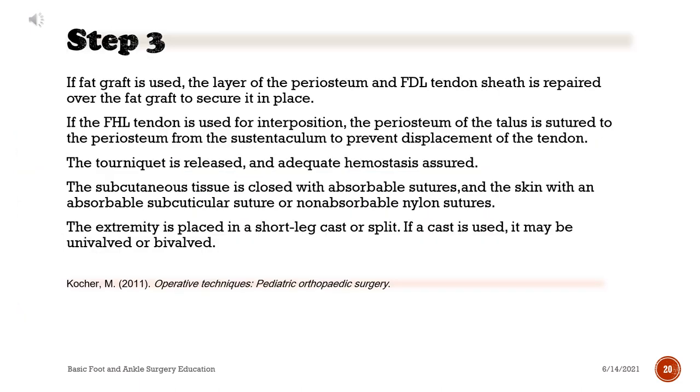If a fat graft is used, the layer of the periosteum and FDL tendon sheath is repaired over the fat graft to secure it in place. If the FHL tendon is used for interposition, the periosteum of the talus is sutured to the periosteum from the sustentaculum to prevent displacement of the tendon. The tourniquet is released and adequate hemostasis assured. The subcutaneous tissue is closed with absorbable sutures and the skin with an absorbable subcuticular suture or non-absorbable nylon sutures.